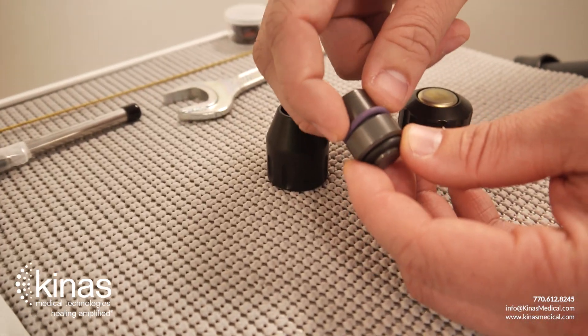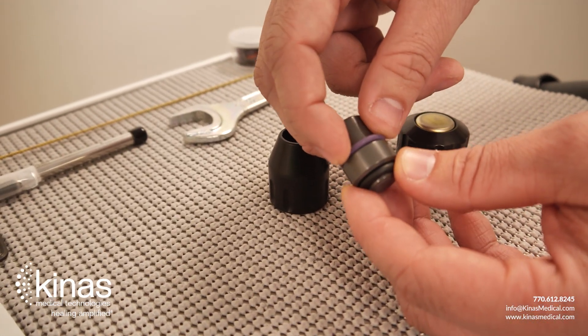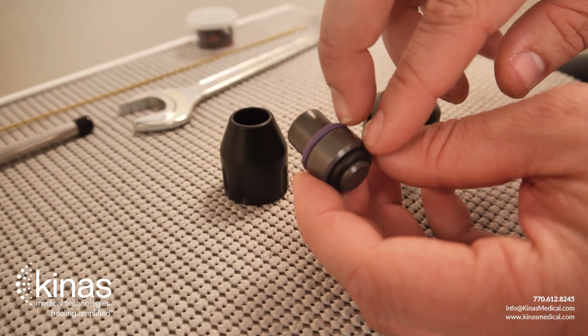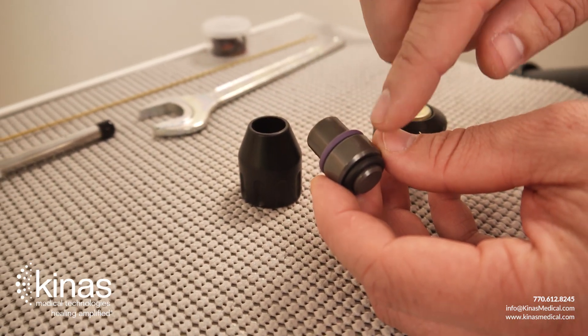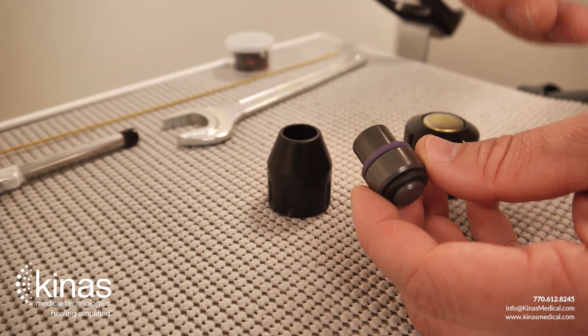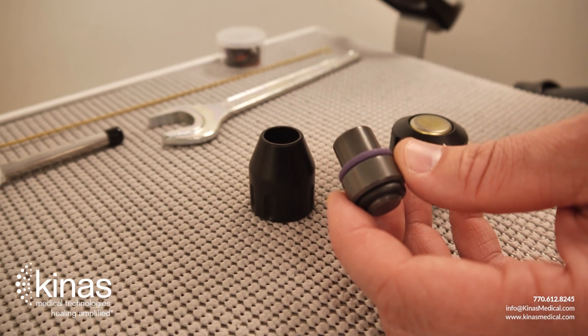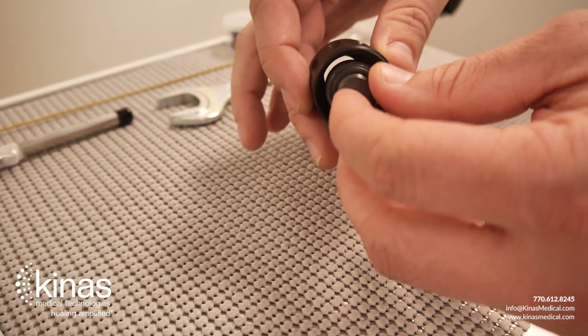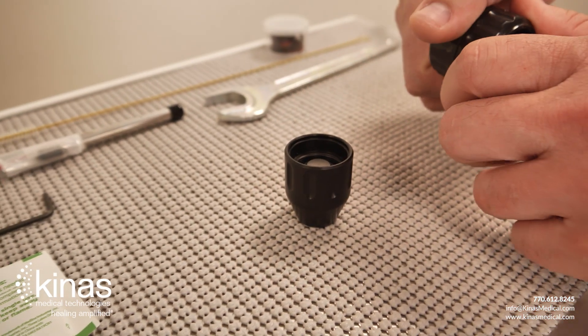Always be sure that when you are done cleaning and go to reattach this to the handpiece, the O-rings are back onto the tip. If you try to operate the handpiece without the O-rings, you can have issues such as your bullet getting stuck or weakened handpiece performance. So always check on the O-rings when cleaning your handpiece equipment.